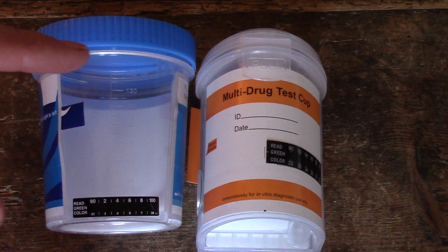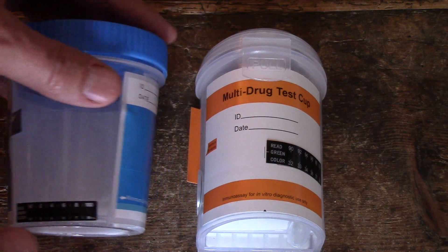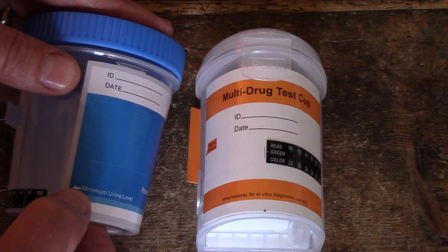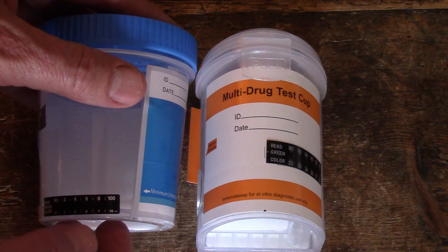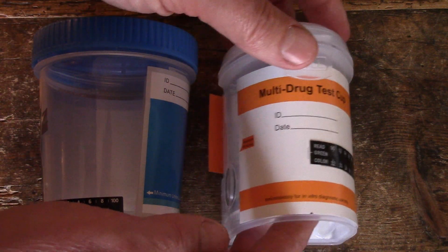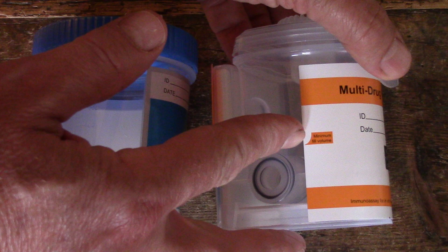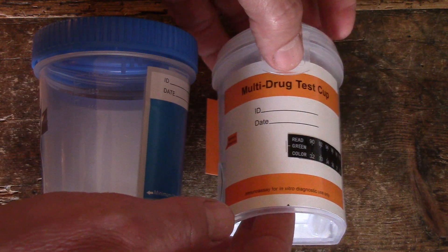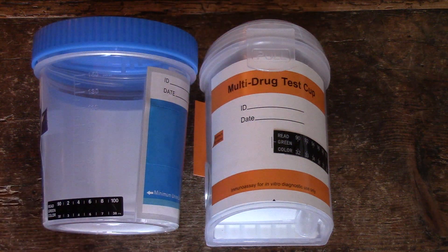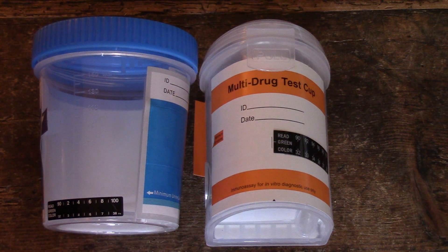These strips are located on the lower section of the cup. On this one you'll see the minimum urine level indicated just over the top of the urine test strip, and on the integrated split key cup the minimum urine level is much higher up the cup. Although this is a lower volume total design, so while the urine sample looks to be much greater, it's actually only a few mils more.